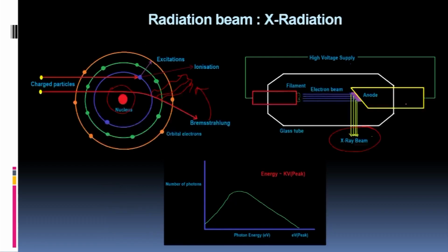If you see the earlier graph, these are the areas with very low energy photons, which are absorbed by the filter, and finally the beam which comes out of the filter is high energy, so its penetration will be higher. This is known as the reduction of the soft component, or you can call it the beam hardening process.